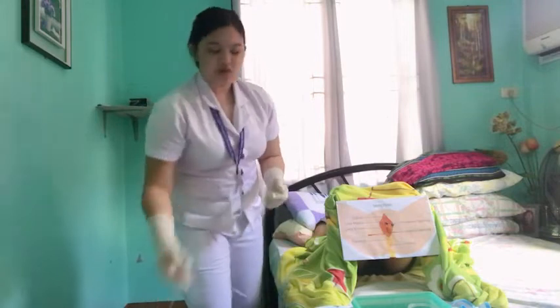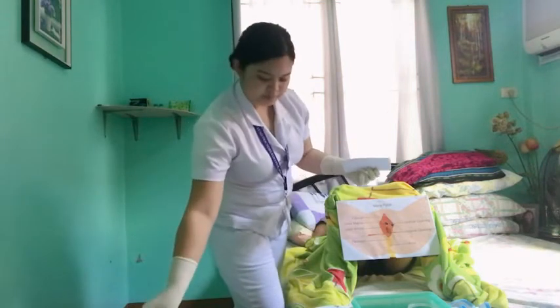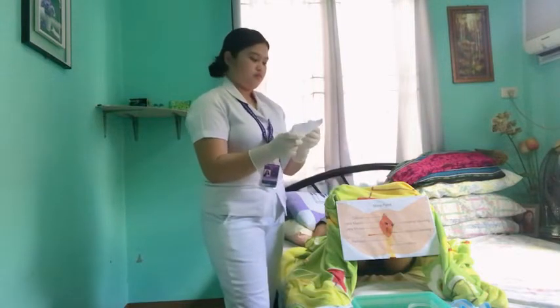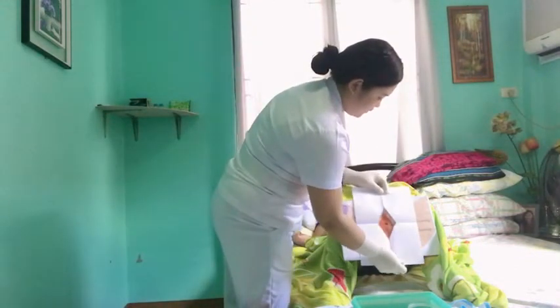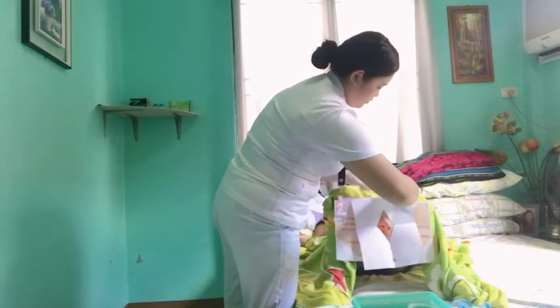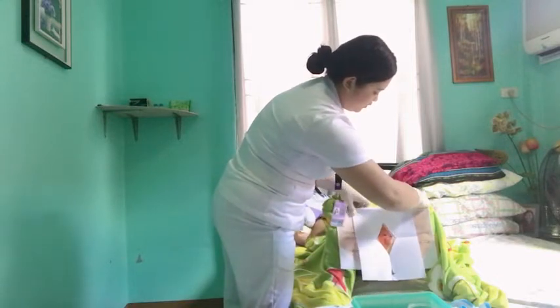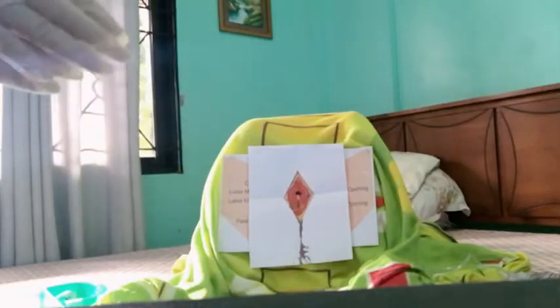So using the forceps, you put the eye sheet. Then after this, I'm going to put the catheter. Connect the catheter with a pre-filled syringe of 10 cc sterile water. Lubricate the catheter first for about 1.5 inches.